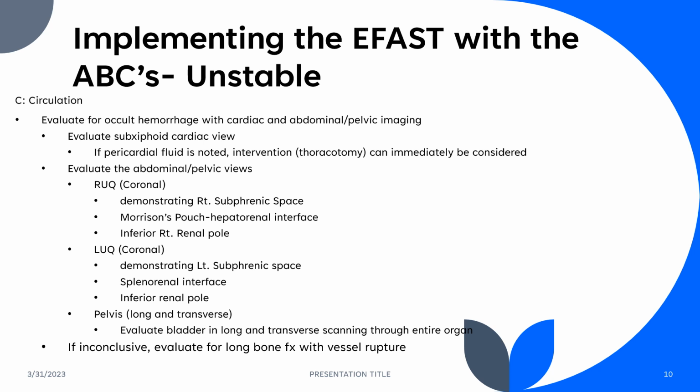Now, when they get to circulation, if the patient is unstable in the circulatory system, ultrasound can be used to evaluate for occult hemorrhage with cardiac or abdominal pelvic imaging. So in this case, you would want to evaluate the subxiphoid cardiac view to look for any fluid collections in the pericardial area.